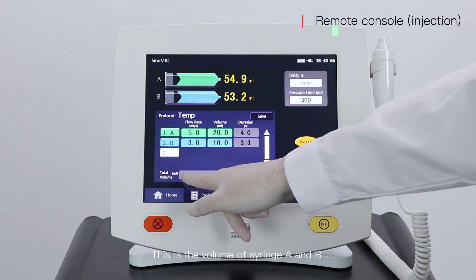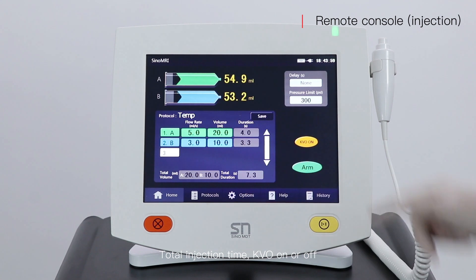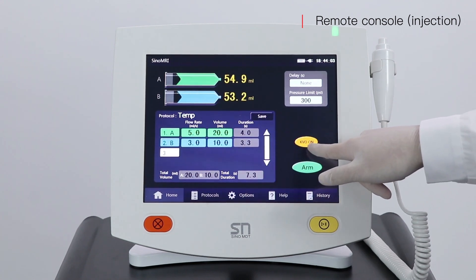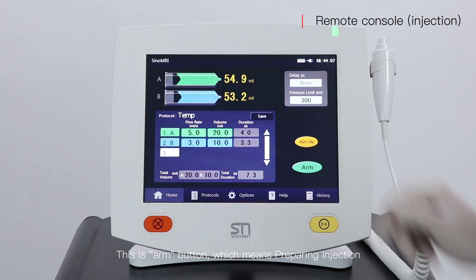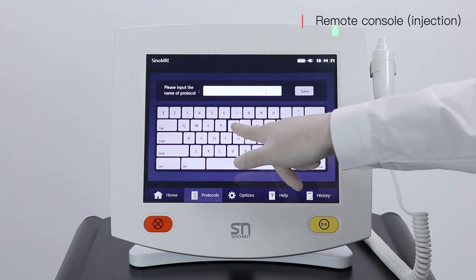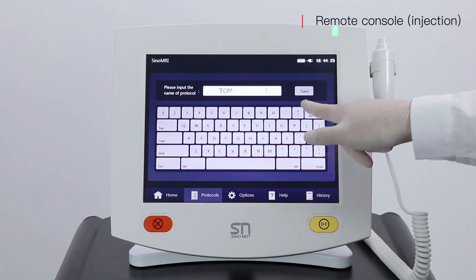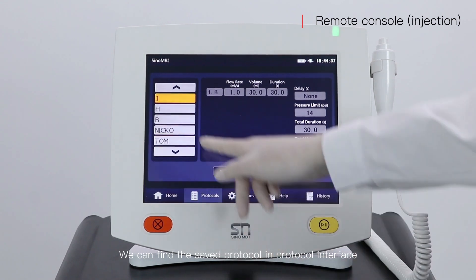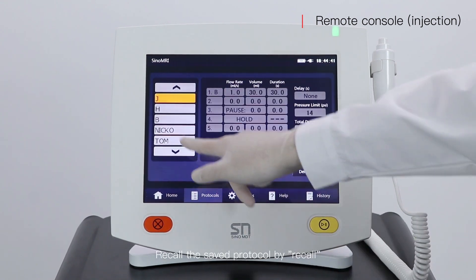This shows the volume of syringe A and B, total injection time, and KVO on or off. This is the arm button, which means preparing for injection. Save this protocol using the save button and you can also customize the protocol's name — for example, type in 'tom'. You can find and recall saved protocols in the protocol interface.